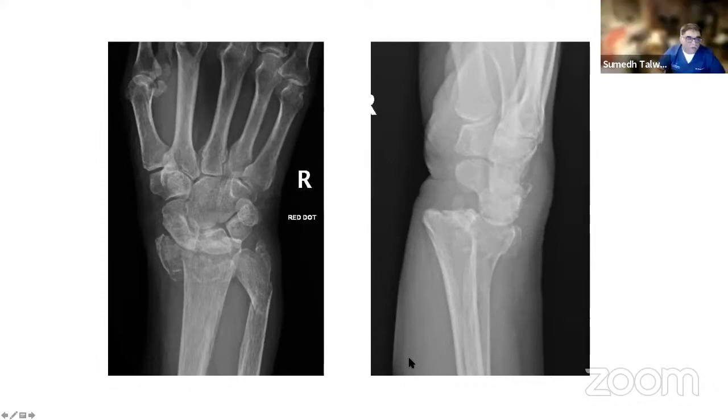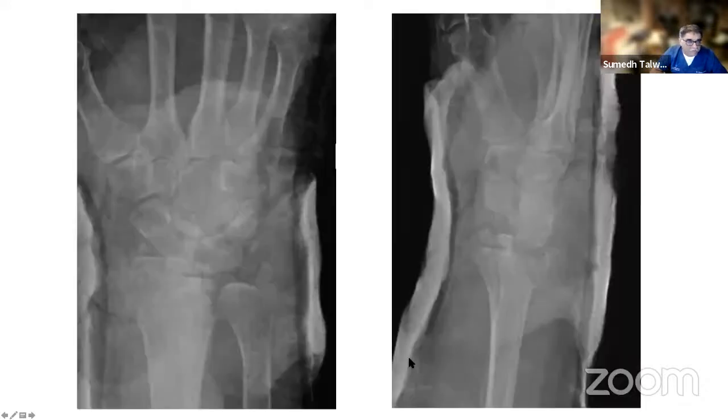Sumed? Yeah, I mean, so looking at the bone quality, it's clearly a shattered, almost dusted distal radius. And I'd probably ignore the ulna for the moment. And one of the things we do with fractures like this is to do a manip intraoperatively. I won't necessarily do a CT scan, perhaps in this case, but following a manip under a C-arm, it gives you a little bit more of an idea. So do you have any post-manipulation views, Zaf? There we go.